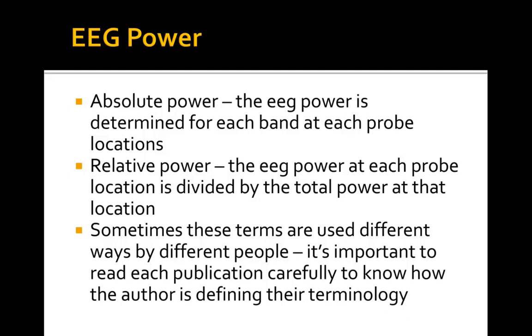So if you want to compare, say, frontal lobe to temporal lobe in the beta range, it's difficult because during a cognitive task or a cognitive state, the background EEG varies naturally. So this is kind of looking at what is the percent of beta power with regard to the entire signal. It's just another way of looking at it.